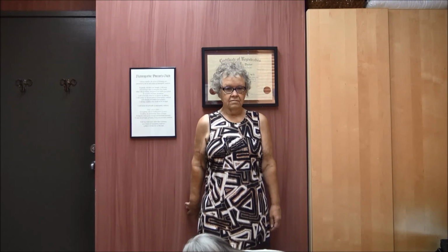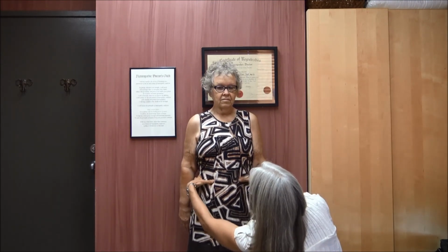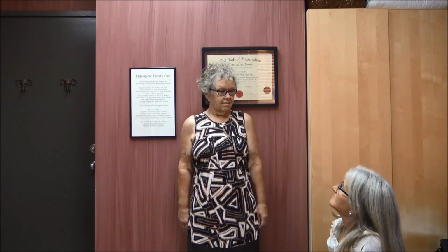I'm going to put the C back in again. And you can see she's even. When I pull it out, her body shifted off again. Feels different, doesn't it? Yeah. And that's how we would fit for a heel lift.